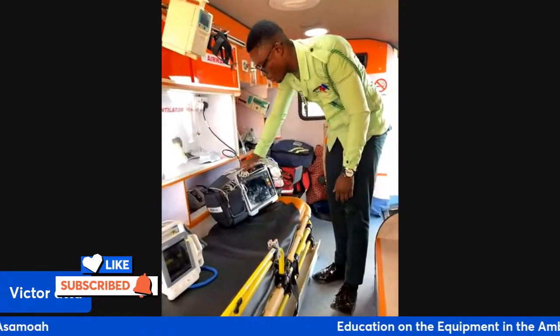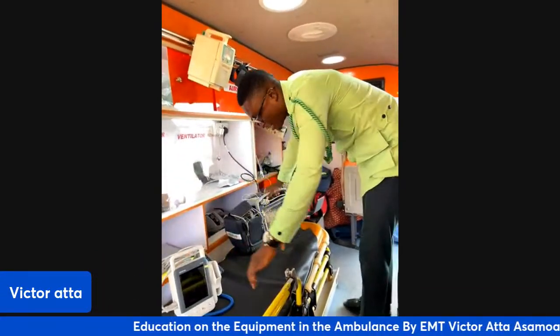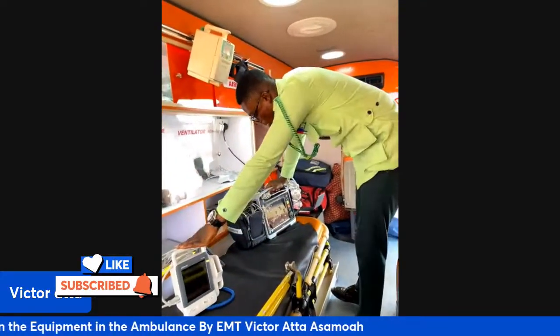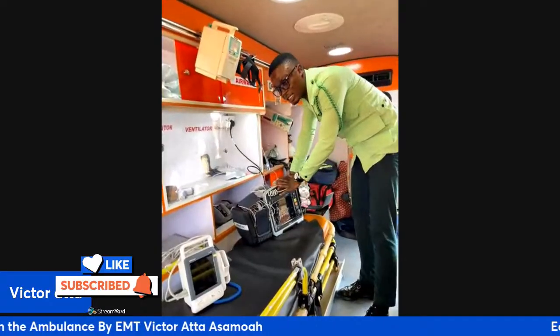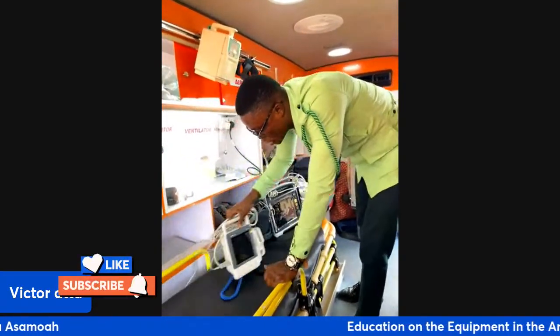And we have the more advanced one. They are all from the same company, the same brand. That's the mid-range small cardiac monitor, and then we have the mid-range advanced monitor. So let's start with the small cardiac monitor.